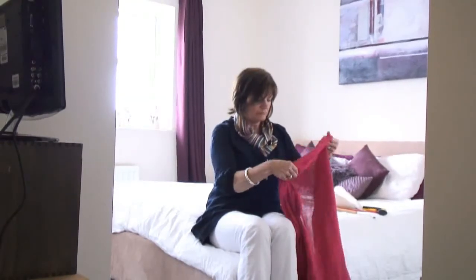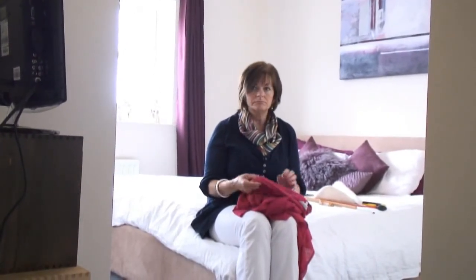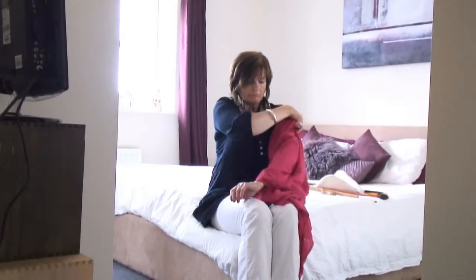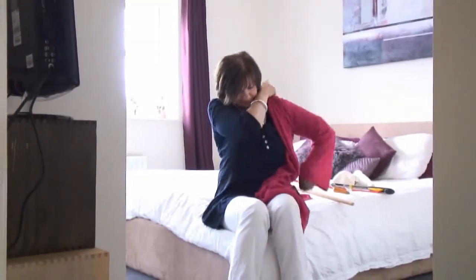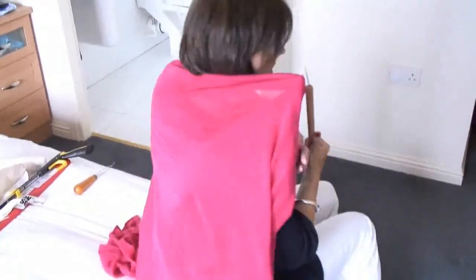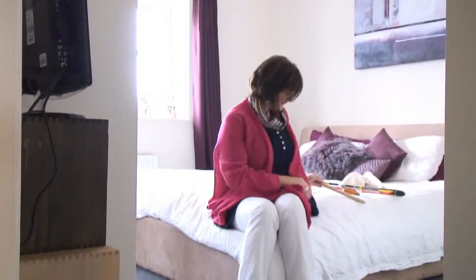Now, Brenda, we're going to look at dressing your top half. If you have some restriction in your shoulder or elbow movement, or you've got poor grip, then there are just a couple of pieces of equipment and a few techniques that can make that a bit simpler. The first one is: if you have one arm that is weaker than the other — particularly say if you've had a stroke — then to dress that side first is a lot easier. You can then use your stronger arm to help pull it up and over. What you can then do is use a dressing stick, using the hooked end to just catch the back of the cardigan, using the arm which has more movement. Or you could use your easy reach again, and then you have more movement in that arm to be able to put it on.